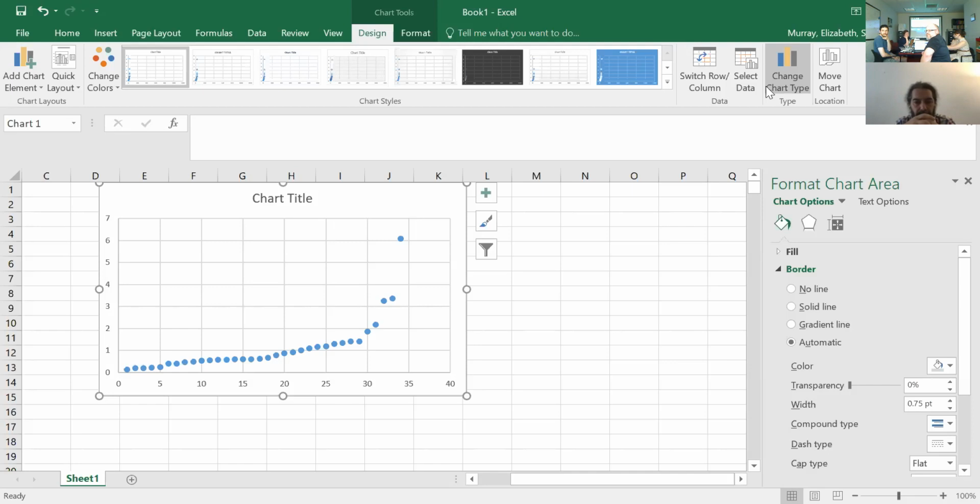So I'm assuming that 20 to 30 are pretty much ASD. But I think I'll just see if it splits up really like that, and if it doesn't, I can look at something else. The problem with valid scans, I can look at percent valid scans. I've done that before. They have different numbers of runs based on compliance, so there's going to be fewer runs in the ASD group for the most part anyway.